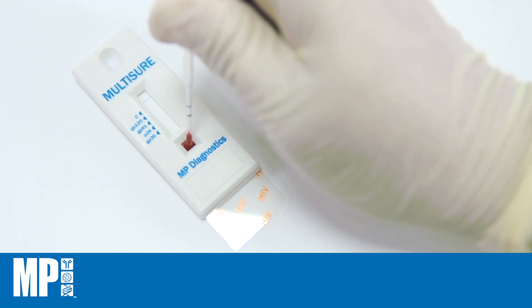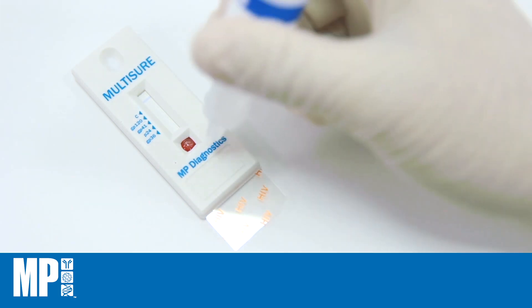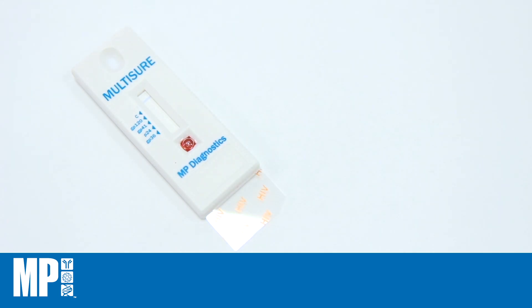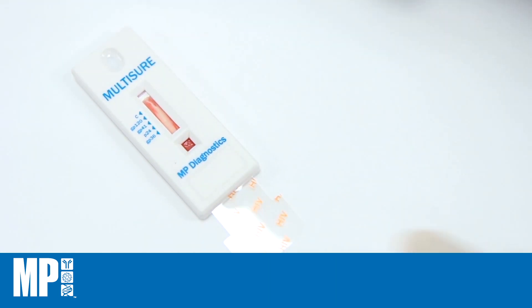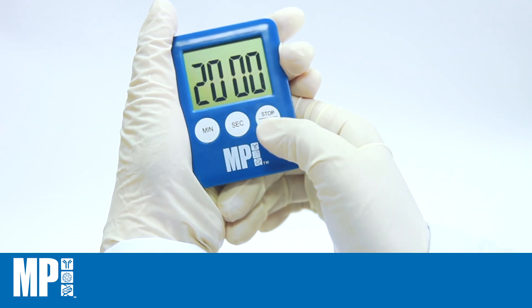Add 20 microlitres of whole blood sample into the square well, followed by one drop of Chase Buffer to the same well. When the sample front reaches the blue indicator line, add three drops of Chase Buffer into the oval well. Ensure that the sample front does not flow out of the test viewing window. Pull out the pull tab until resistance is felt. Add one drop of Chase Buffer into the square well. Start timing and read the results at 20 minutes.